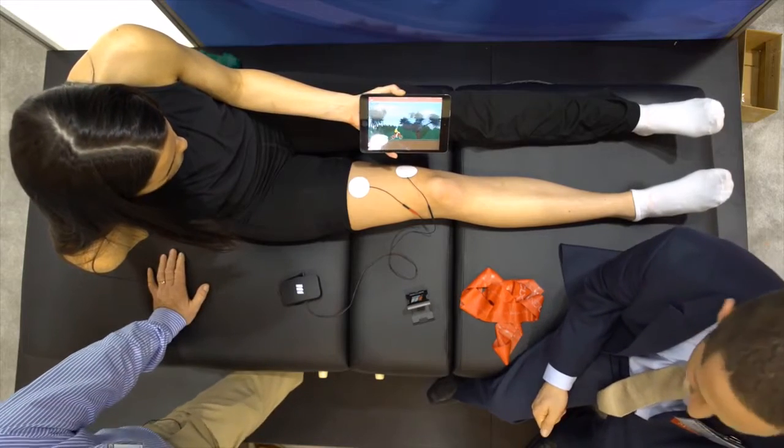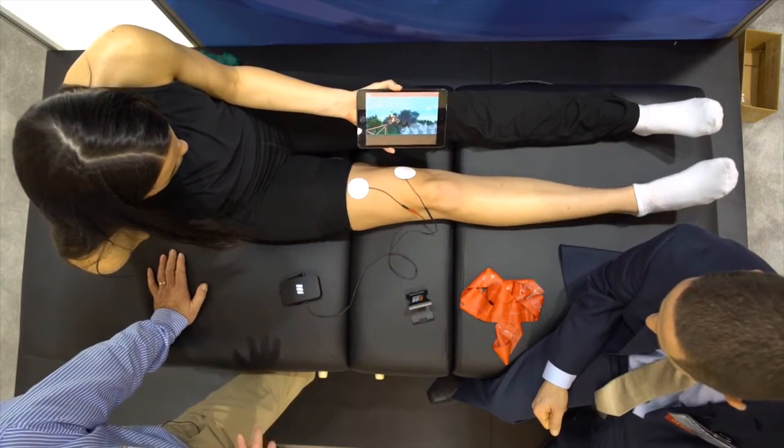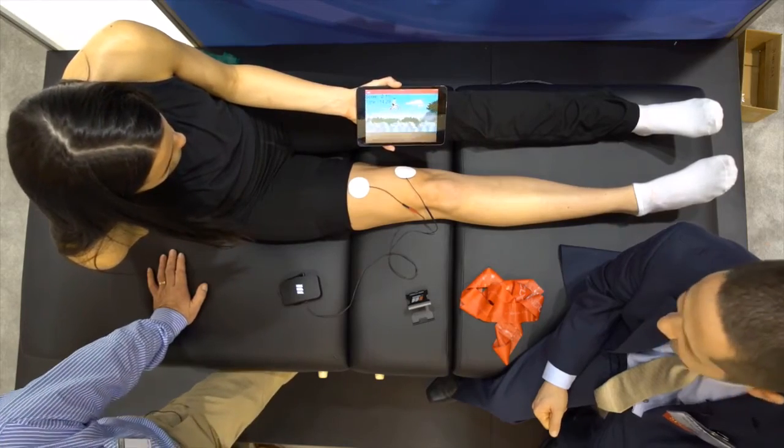Our patients love this — they're extremely compliant. It helps with muscle re-education, and not only for rehab, but strength and conditioning people are coming in and are really interested in this too.